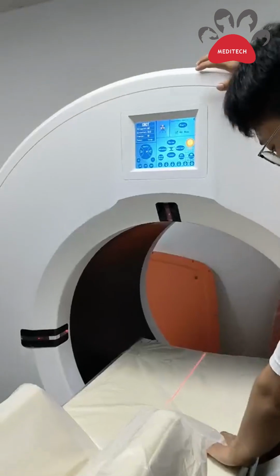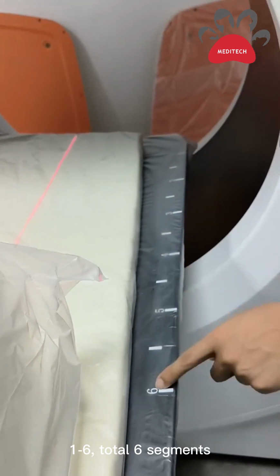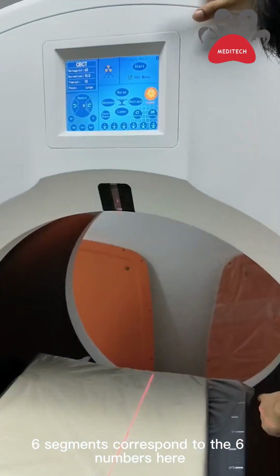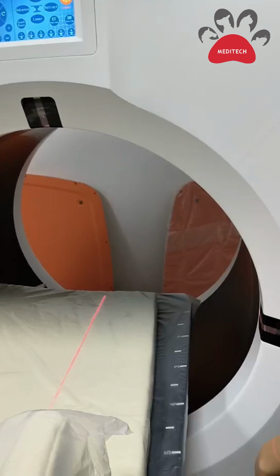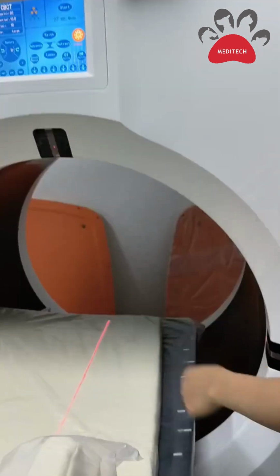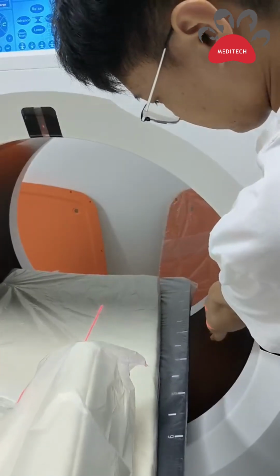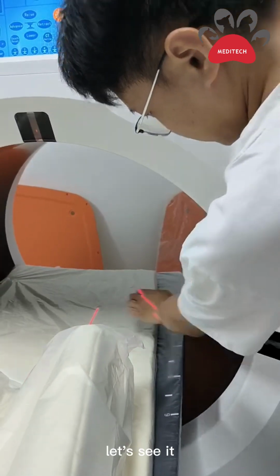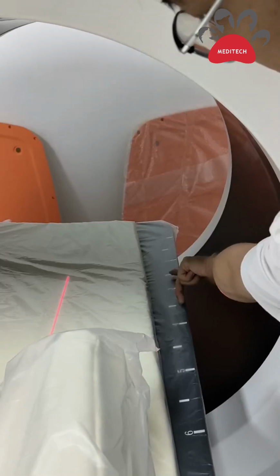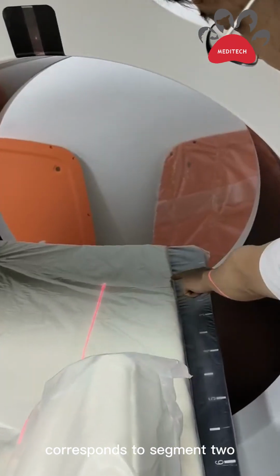OK. There are several segments on the table, 1 to 6, total 6 segments. The numbers correspond to the 6 areas here. Press the number 1. We can see the horizontal laser positions on segment 1. Press the number 3. The horizontal laser positions on segment 3. Let's see, the animal's mouth almost corresponds to this area. Number 2 corresponds to segment 2.